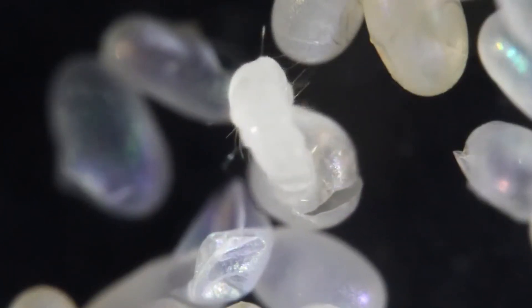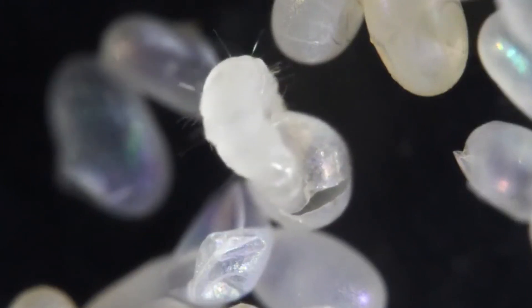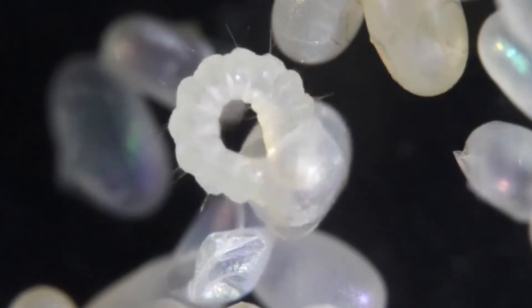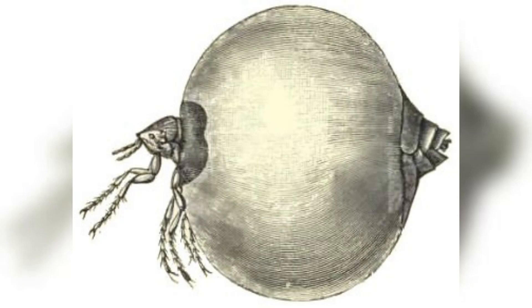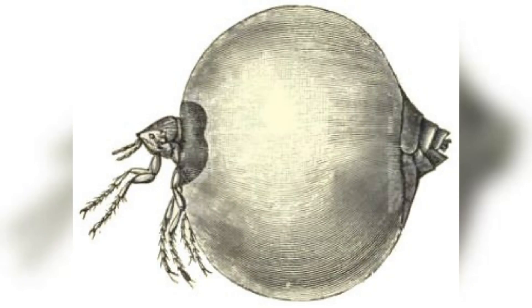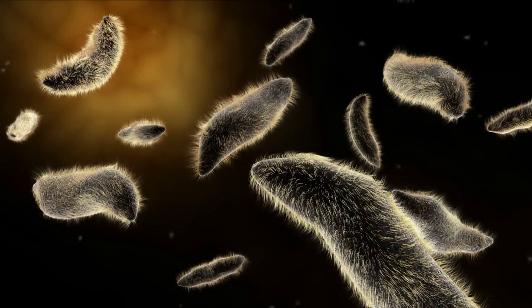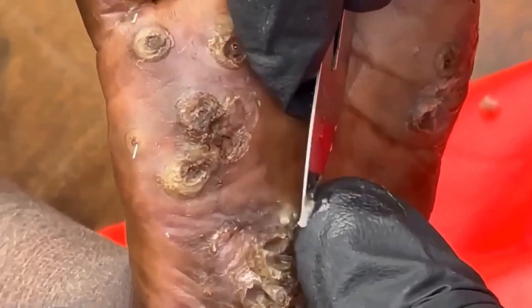The impregnated female sand flea, Tunga penetrans, exhibits distinctive features under dermoscopy. The head is characterized by a central pore, and the distended abdomen appears as a bag of eggs. These unique dermoscopy findings serve as definitive diagnostic criteria for tungiasis, enabling healthcare professionals to confirm the presence of the parasite.